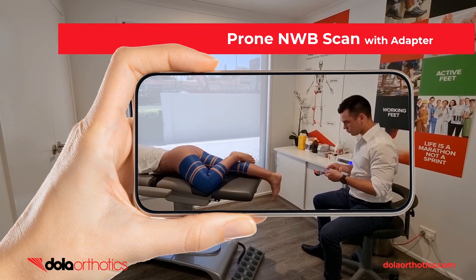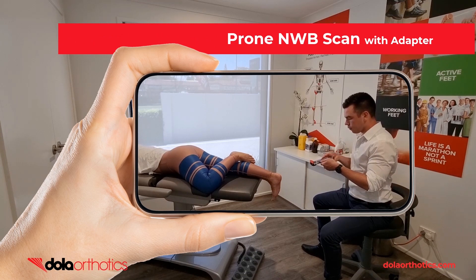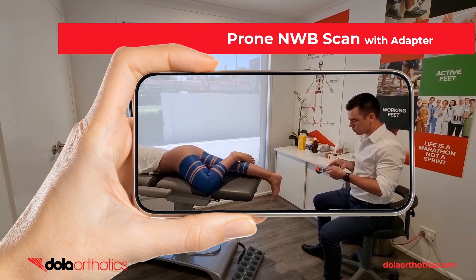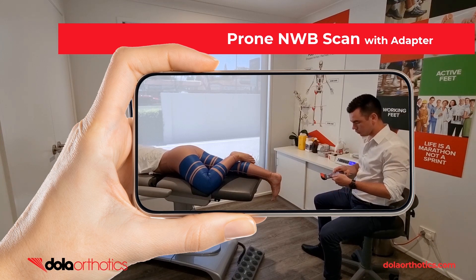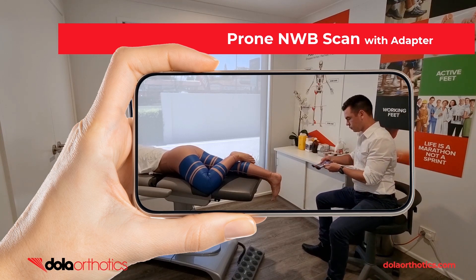Here is a demonstration of the iPhone with the Dollar iScan adapter being used to capture a prone patient non-weight bearing foot as positioned by the clinician or as strapped in treatment directed testing. The adapter provides easier visualization of the screen during the scanning process, allowing the clinician to remain seated.